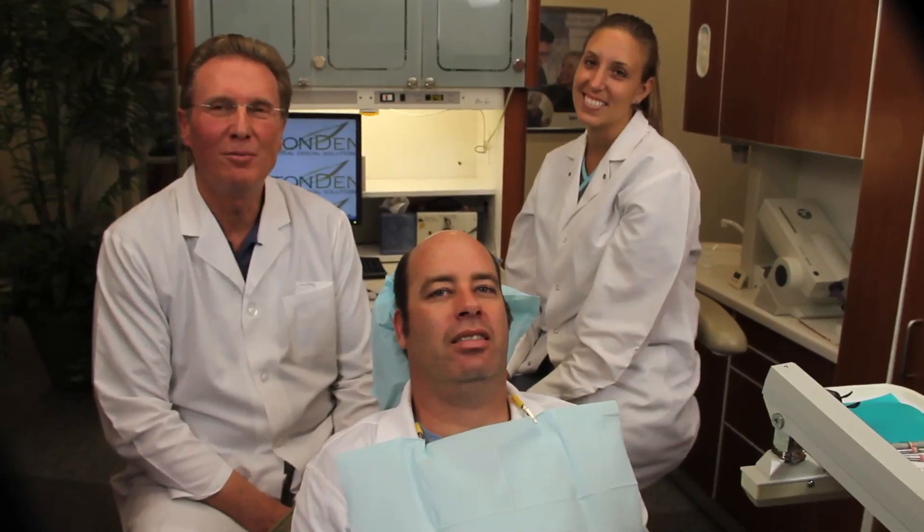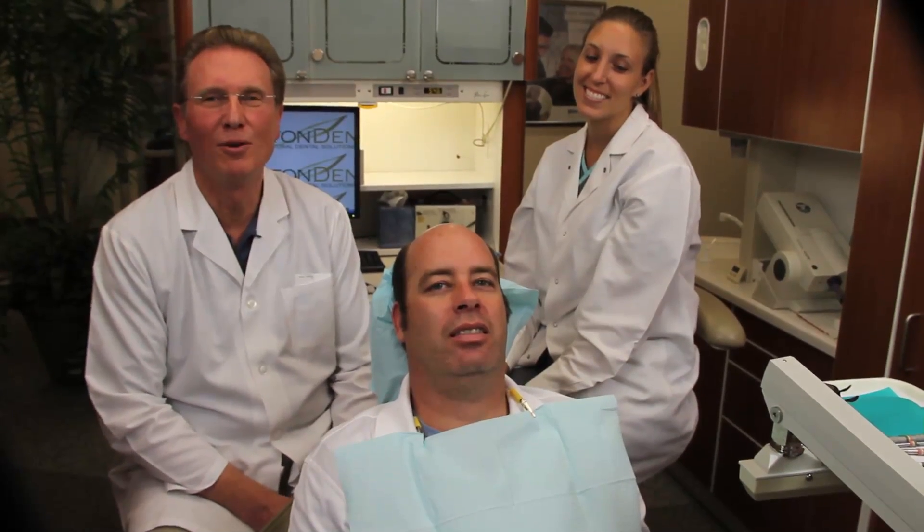First, I'd like to introduce my assistant, Sarah, and my patient, Eric, who will assist me in demonstrating the safe removal of mercury fillings.